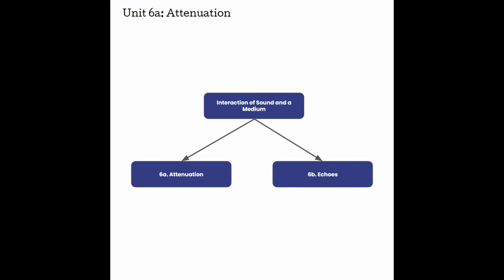The whole reason diagnostic medical sonography exists is because sound in the medium, which is our soft tissue body, will interact in a way that returns echoes to the machine for processing and display. Understanding how echoes are created is also going to help us to better understand some of the physical limitations on creating a diagnostic image. Remember, we are not here learning ultrasound physics to build a machine or repair one or make the next super fantastic super duper transducer.